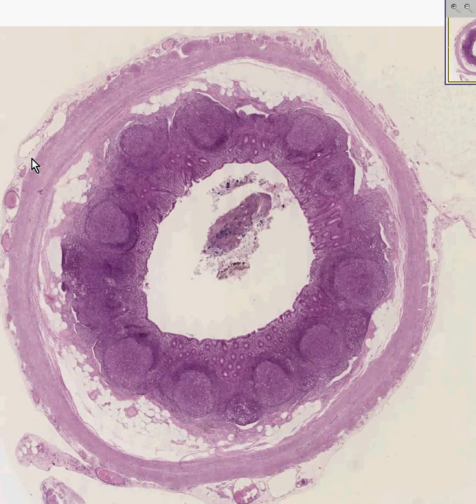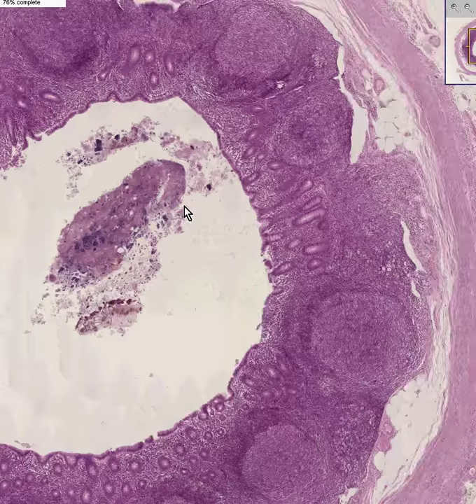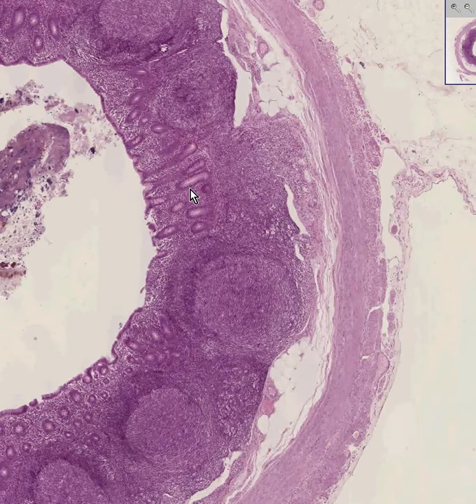Here is the world's most normal looking appendix for the reasons we will soon describe. If a surgeon took out a lot of these appendixes or appendices and they looked like this, he would eventually get into trouble because he would be taking out normal appendices. Let's look at the salient features of a normal appendix in its perspective as being a classical, typical example of just about any part of the GI tract.